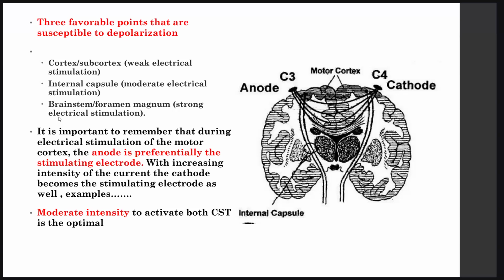And motor evoked potential is an anodal stimulation. What does that mean? It is not like NCS. In NCS, the current is coming out from the cathode. In MEP, this point has a detailed physiologic basis, related to the organization of the cortical neurons and their physiologic differences from the peripheral nervous system. We cannot go through it today because it's a very long story. But the anode is going to stimulate.